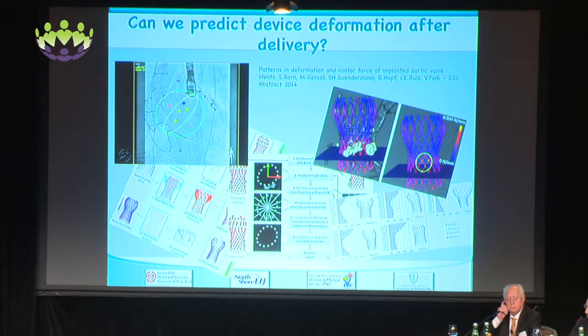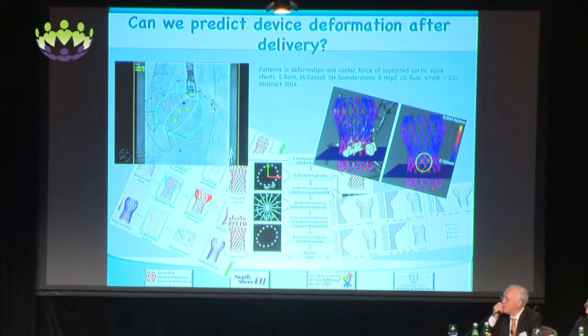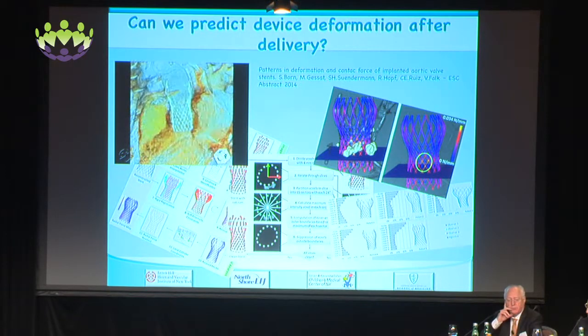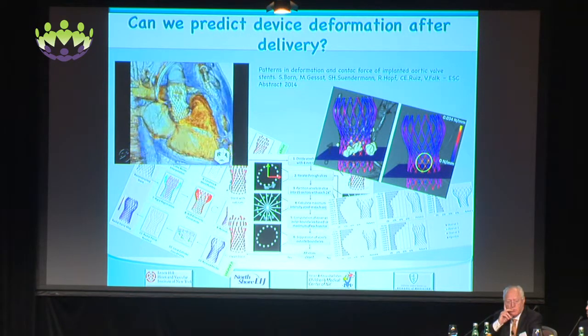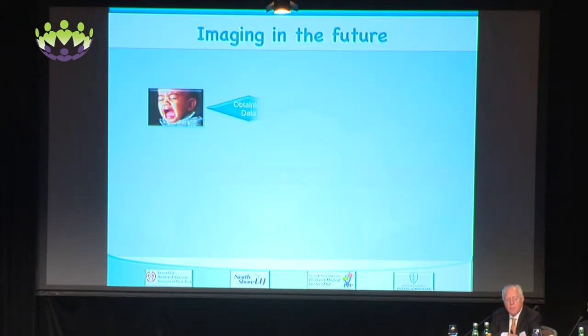This is something we have already started working on with Professor Falk, who is no longer in Zurich, I think he's in Berlin now. He is developing mathematical modeling with our group that can predict what deformation of the device will take place once you place it in that specific location. We started working with that with the TAVRs.